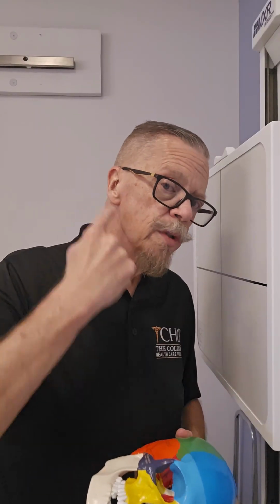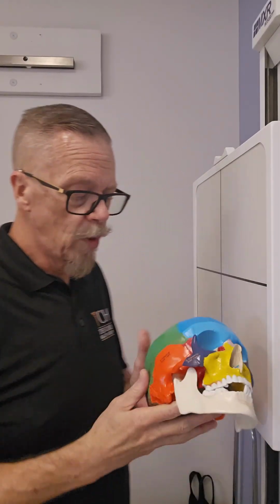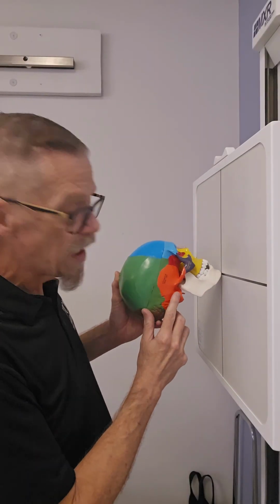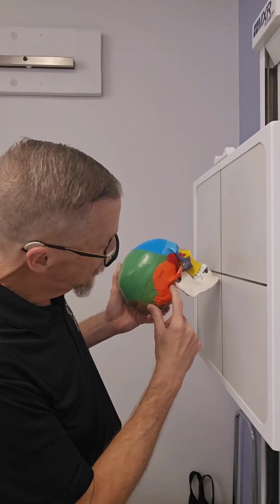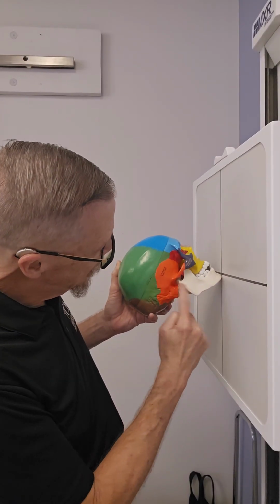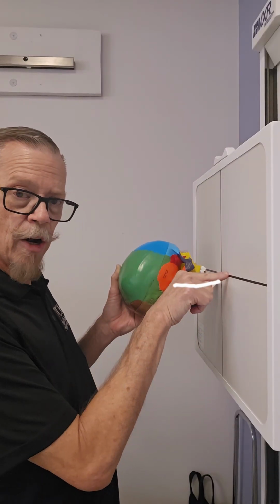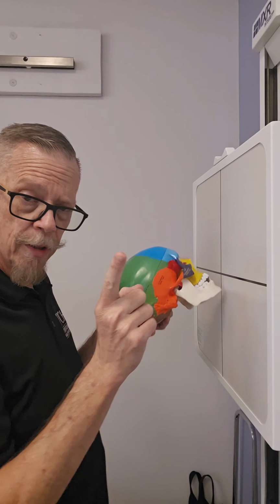Another big one we use is the MML, the mentomeatal line. So from the mentum to the EAM, a line from here to here. Obviously, we're going to have a lot of extension on the skull. And from here to here, we want that perpendicular to the IR. Okay, does that make sense so far?